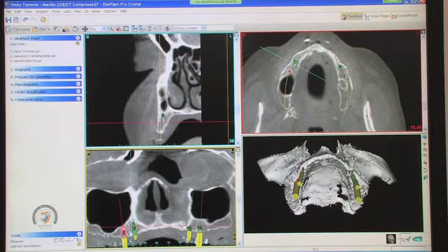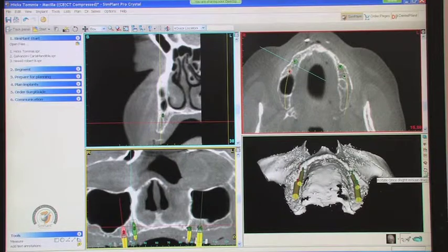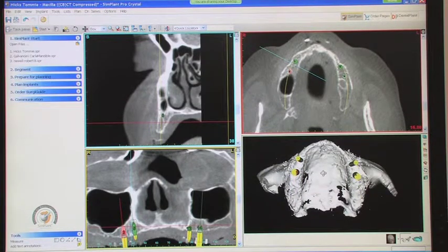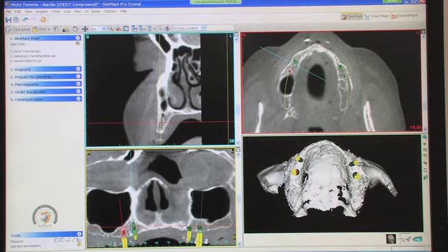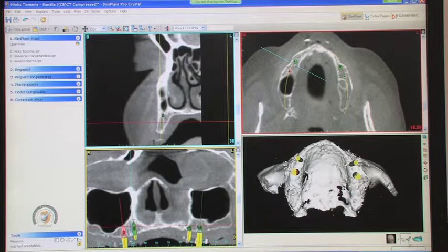From your original Rx, the plan was to place four implants, do a locator overdenture, and place the implants in the second premolar and canine areas. That may have to change slightly — let's go through it and see what you think.